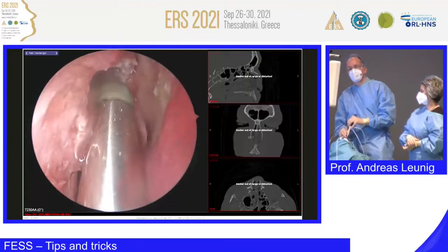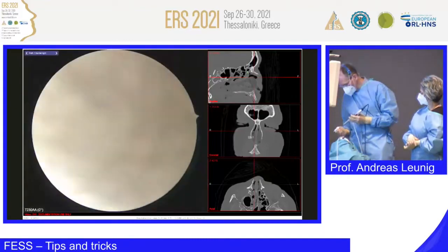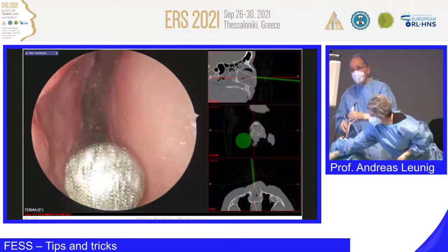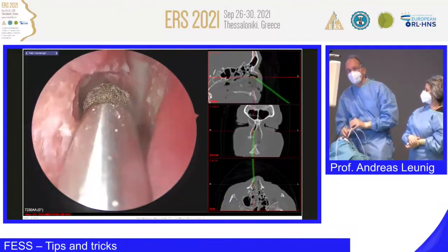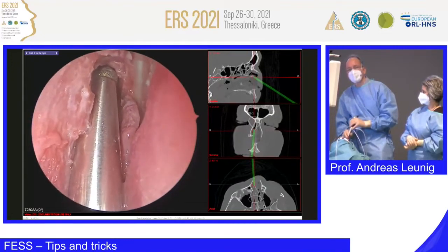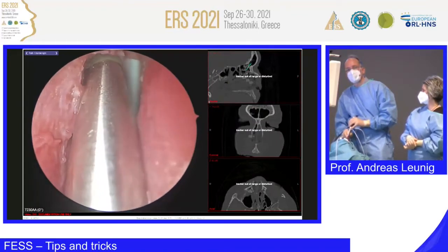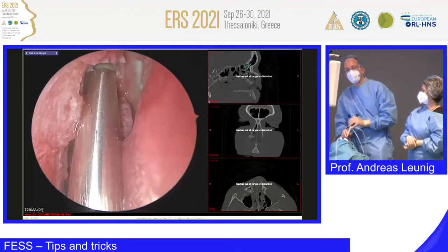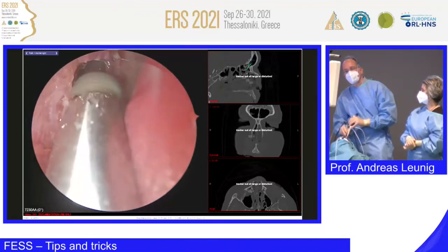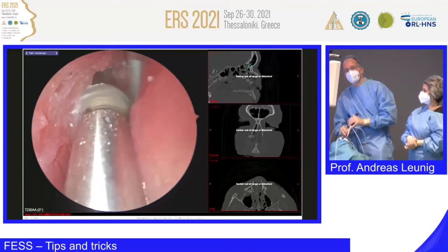Okay, so now, when you stay on one side and you want to open only one side, you can do it differentiated. You can do a partial, more aggressive opening, and according to the EFSS classification of Peter Wormald, there's a grade 4 when a part of the internal beak, and now we are touching the internal beak, is removed. And when you remove the whole internal beak, then it's a grade 5 opening, a complete one-sided opening. I would remove this a little bit more to get more access.